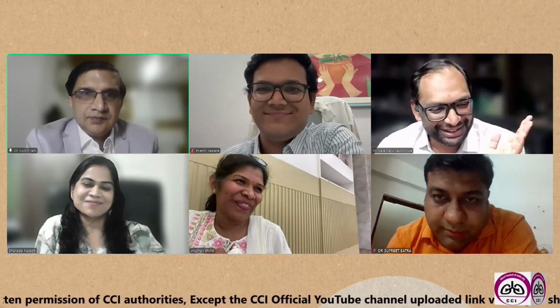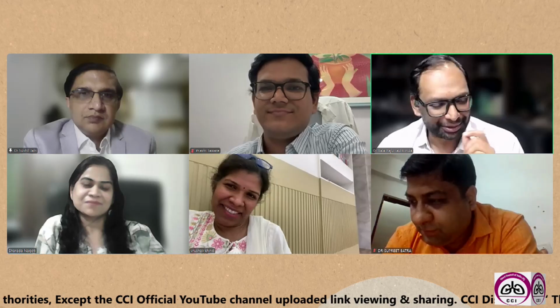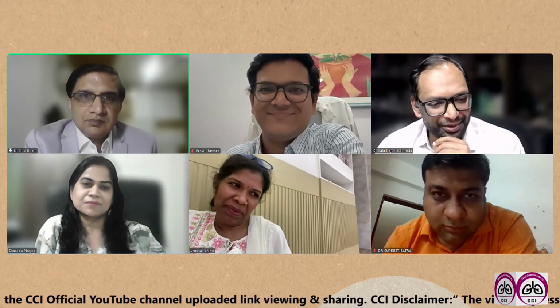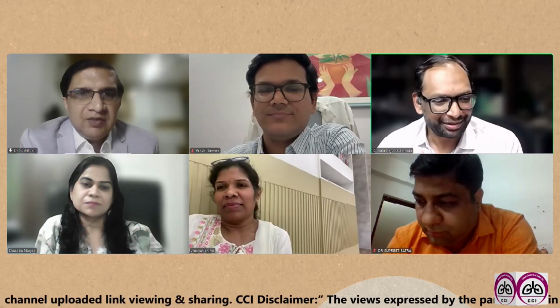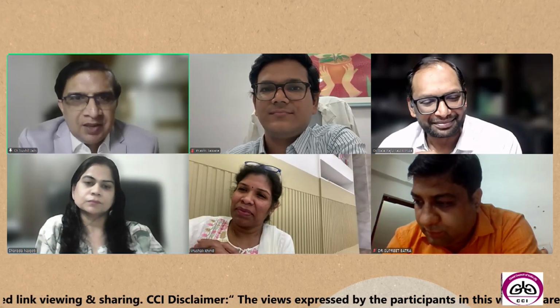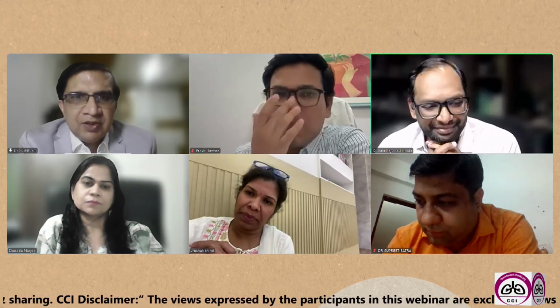And speak to the pathologist, like every procedure is an exam for me, so that did I pass or not, because I don't have the luxury of ROSE in my center. So the communication is only after the procedure. Unfortunately, I think when we talk to them, when we call up and talk to them about what we are expecting and what we are looking forward to, that makes a lot of sense. Just the notes may not be enough.